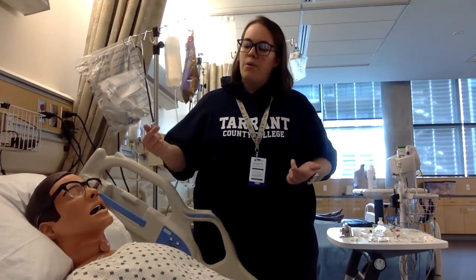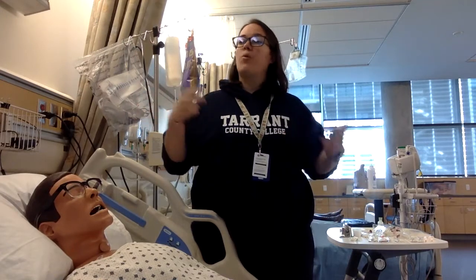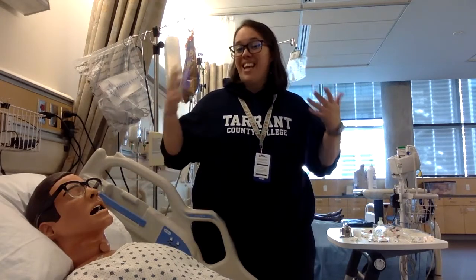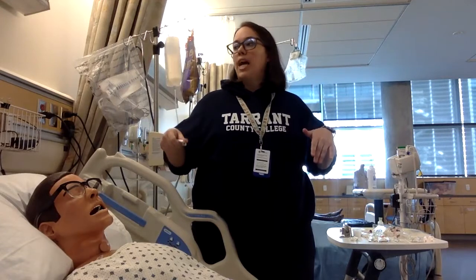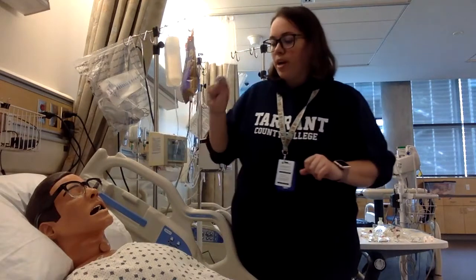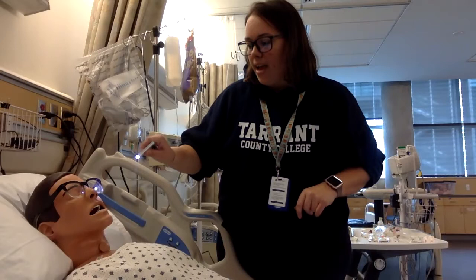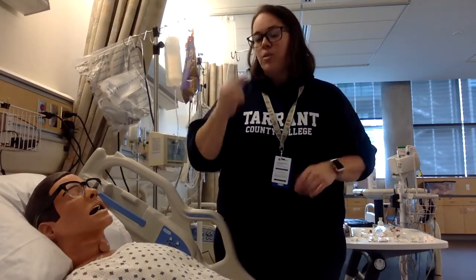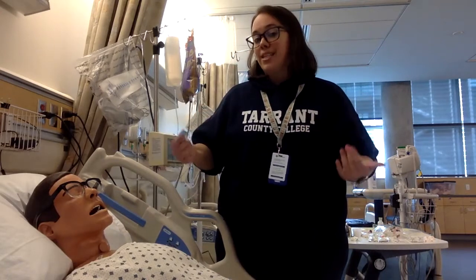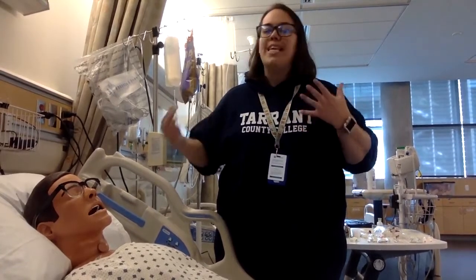When assessing the pupils, the first step is I would normally turn down the lights. If I have the lights on, it's going to skew my assessment of how his pupils are reacting, because there's already light in his eyes. So normally I would turn the lights down, which I don't think I can do right now. Then I'm going to take my pen light and start from the outside and move in. What I'm looking for is that as it enters his eye and shines on his pupil, it should go from larger to smaller. When it gets smaller, that's telling me a lot about the equal reaction.